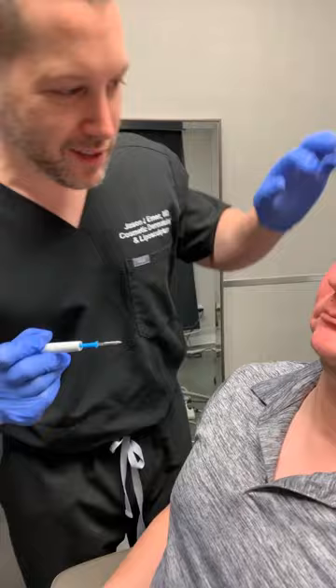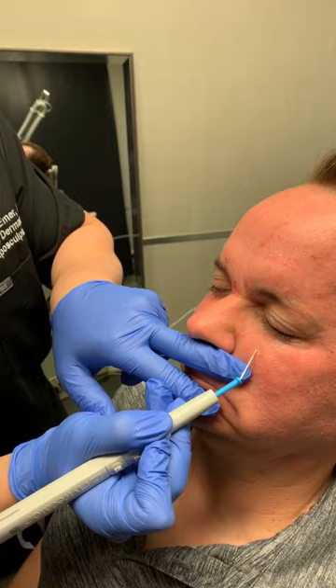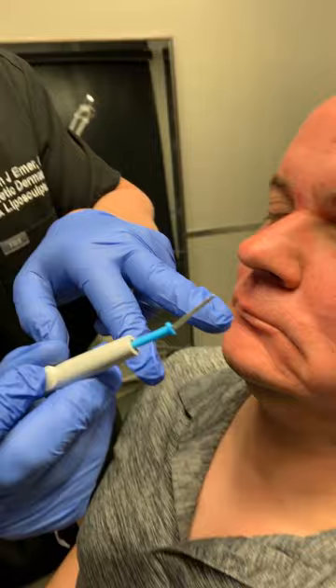Now number three — this is the cherry on top — going to a dermatologist. He's got a lot of these little moles. Take a look at these right here. I'm going to burn this little guy. He's going to feel it a little bit. Look at that — that thing's just peeling right off. That's called the keratosis. They come with age, and if you do it right, you can literally just peel that guy right off.